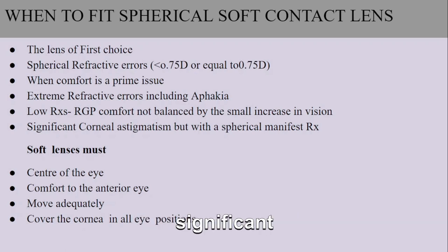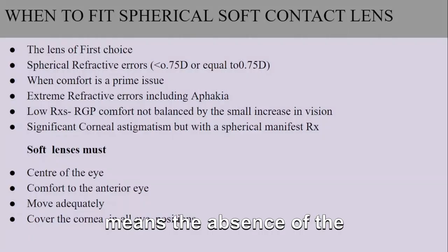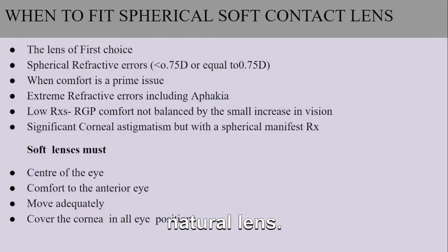Number 3. Extreme refractive error and aphakia. For individuals with significant refractive errors, or those who have undergone cataract surgery resulting in aphakia, meaning the absence of the natural lens, spherical soft contact lenses can provide effective vision correction. These lenses can be customized and made to accommodate high vision power, allowing for clear and comfortable vision.